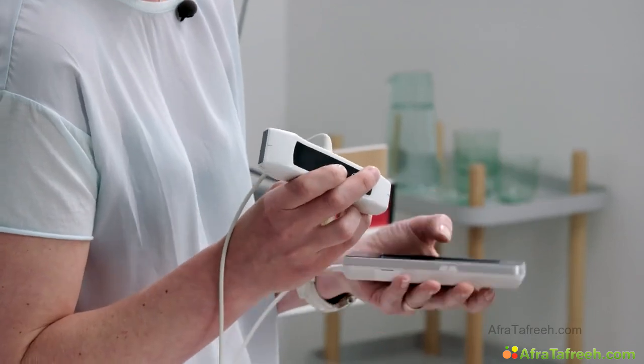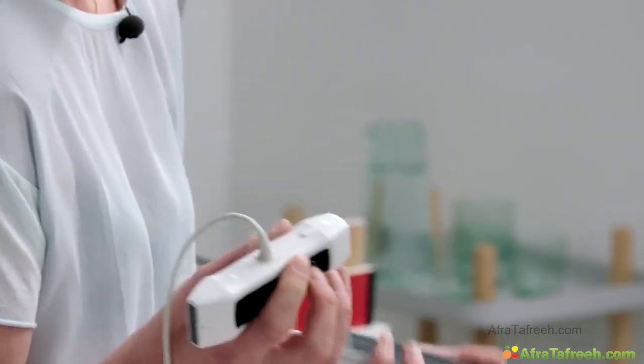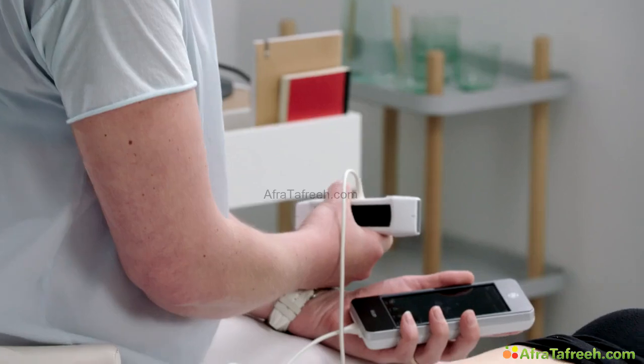The navigation point on the transducer is shown by a dot or by a light. In this case, it's shown by a light. We're looking at the uterus. In some cases, it's empty, but in the most lovely cases, it's filled with a baby and it's jumping around. So it's very important to know what you're doing while you're scanning.